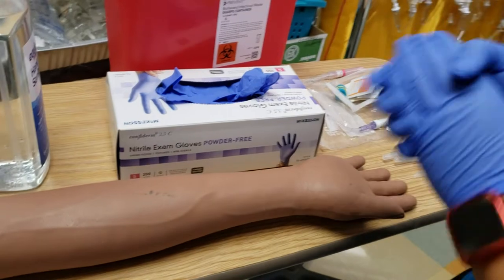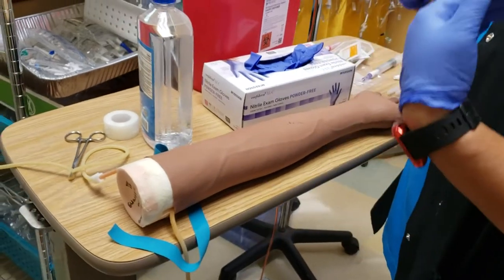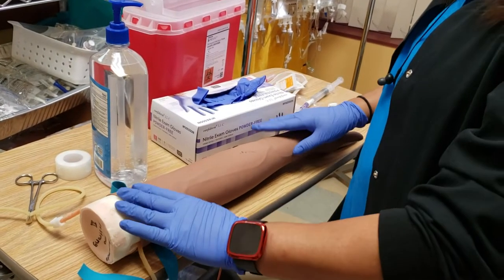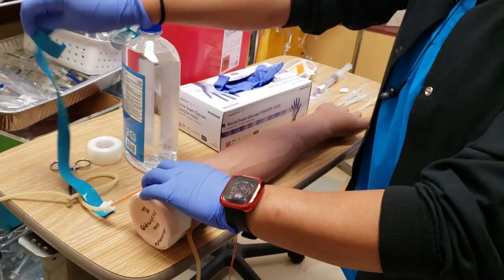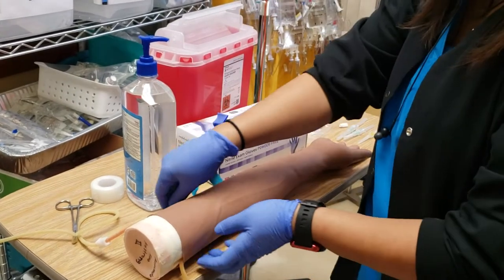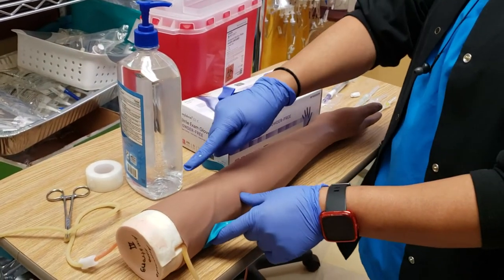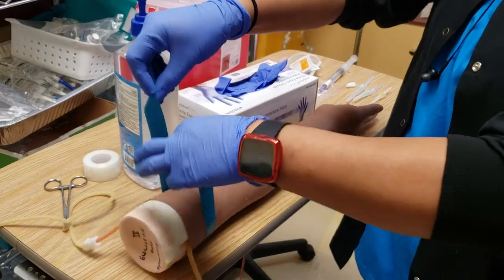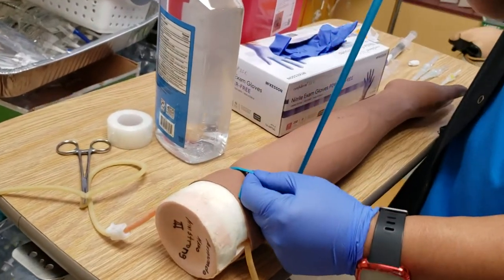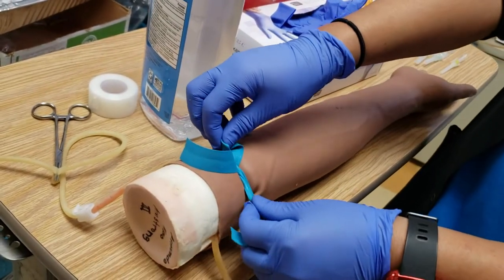After I put my gloves on, I'm going to find the patient's vein. When you're starting an IV, it's best to put yourself in a comfortable position and also position the patient's arm so they're not holding it up. Make sure they're stable on the bed or whatever surface. Then I'm going to take my tourniquet. When you find the vein — whether it's here or here — you want to put your tourniquet just above. I'm going to wrap it around the patient's arm, tighten this part, pull this tight, cross, tuck underneath and pull, and you've got that pretty tight.